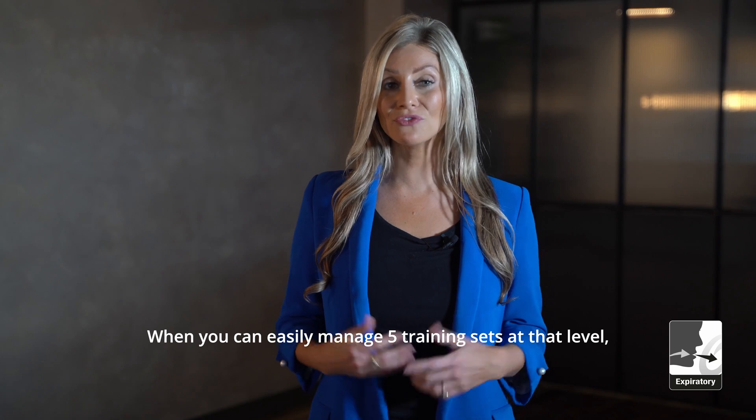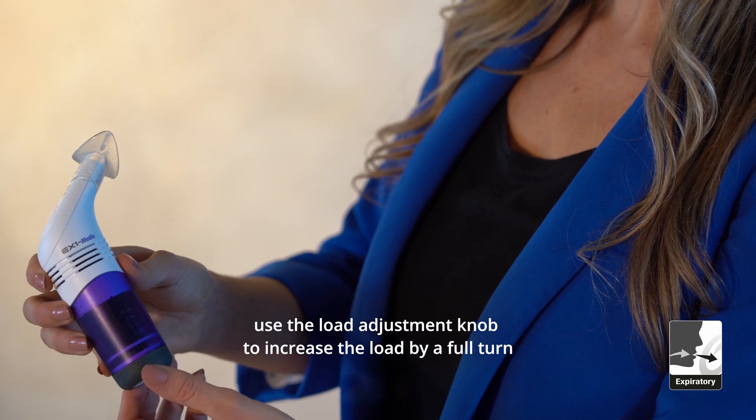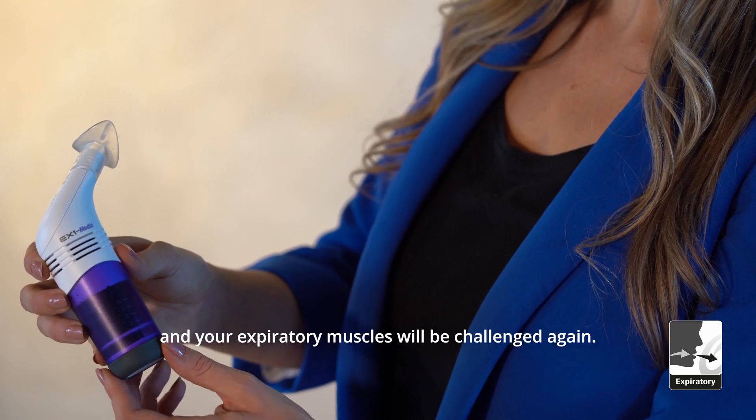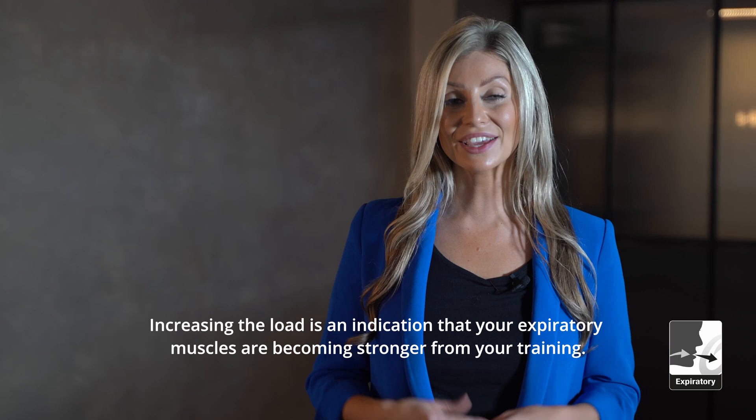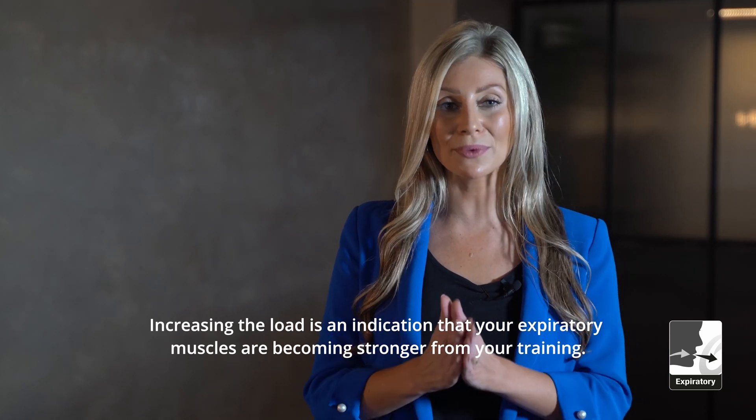When you can easily manage five training sets at that level, use the load adjustment knob to increase the load by a full turn and your expiratory muscles will be challenged again. Increasing the load is an indication that your expiratory muscles are becoming stronger from your training. Well done.